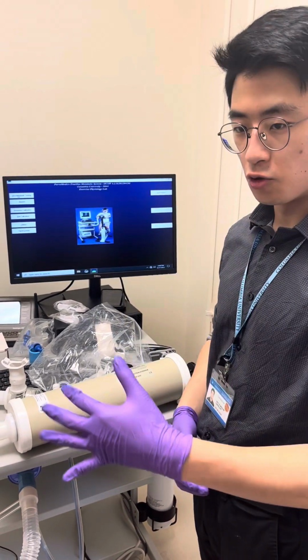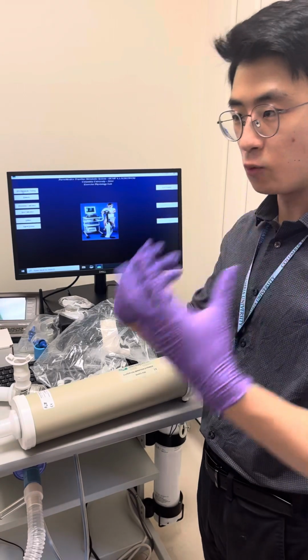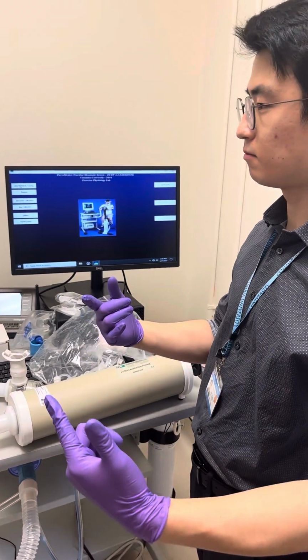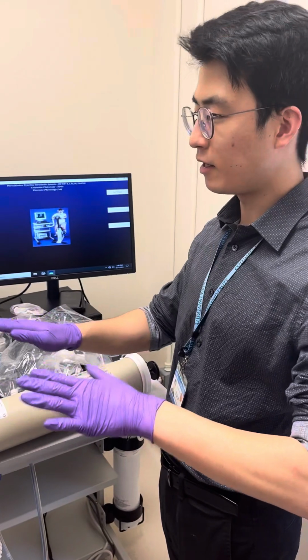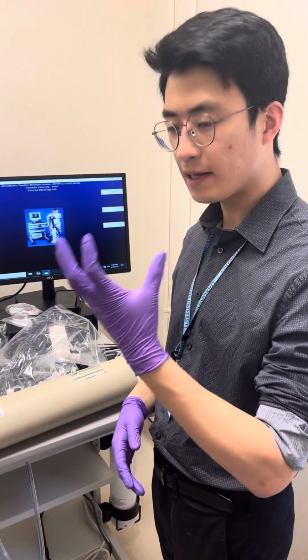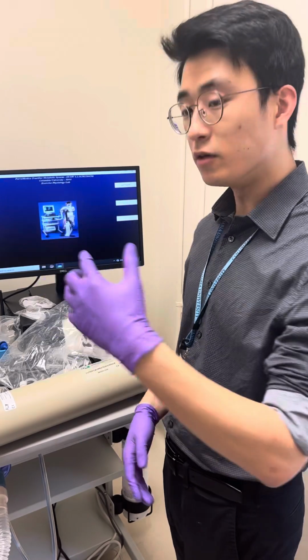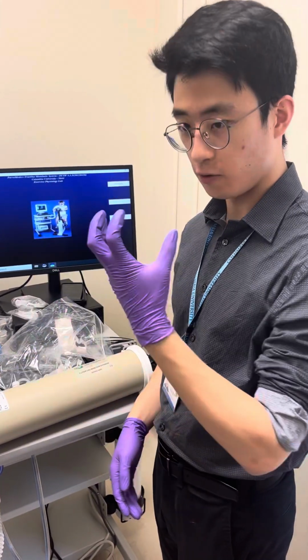And so they might drool into the device, and when you're breathing in without swallowing your spit, it'll dry out your mouth and your throat, and you have to do this for about 24 minutes, or a little longer than that, with the resting period and everything. So I think it's about 18 to 20 minutes actually. In that time, if you're just breathing through a mouthpiece with a nose clip on, it can really dry your throat. So it might be a really good idea to have the subject drink a little water before you actually start.